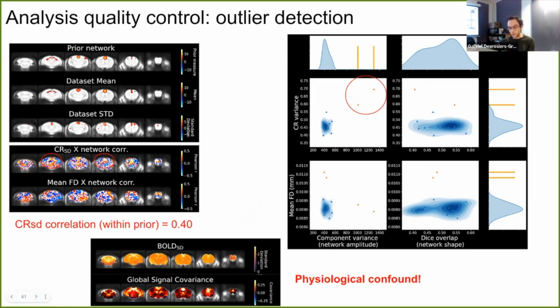And these particular physiological confounds really overlap with the default mode network. And so that's why these two scans were driven by very high variance, or had inflated variance explained. And a way to correct for those confounds was to either apply a high pass filter in this case, or a white matter CSF mask regression was sufficient.